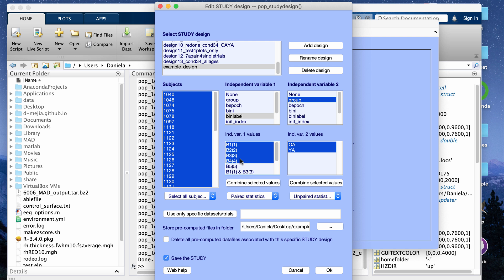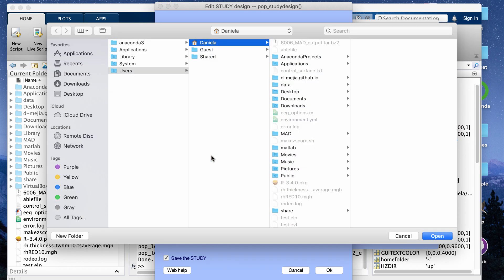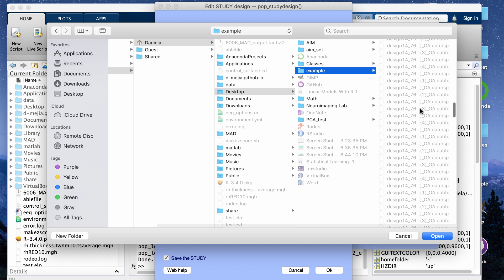For this analysis I used bins 1, 2, 3, and 4, which will create four separate time frequency plots for the first variable. I then added a second variable: group — older adults and younger adults — which is already labeled in the subjects file when loaded in. These are unpaired statistics. Based on the information I selected, I'm going to produce eight time frequency plots: four conditions for older adults and four for younger adults. I've already created an example folder on my desktop and already ran this analysis.